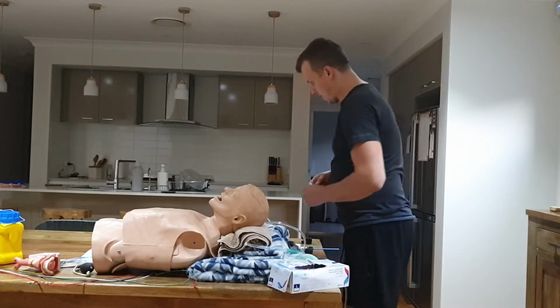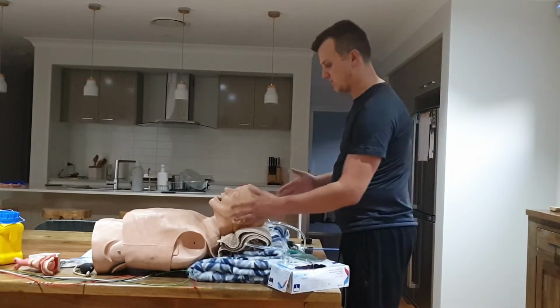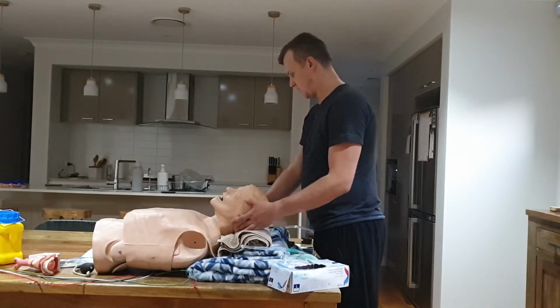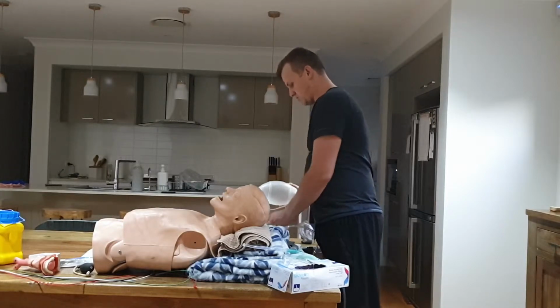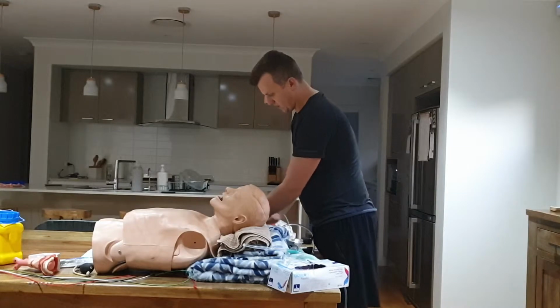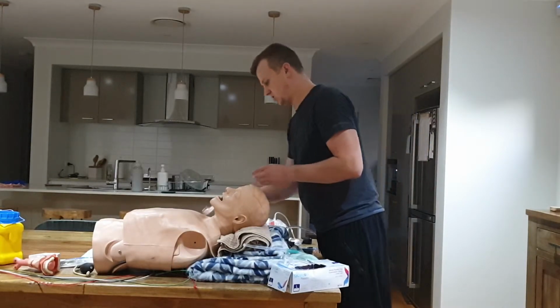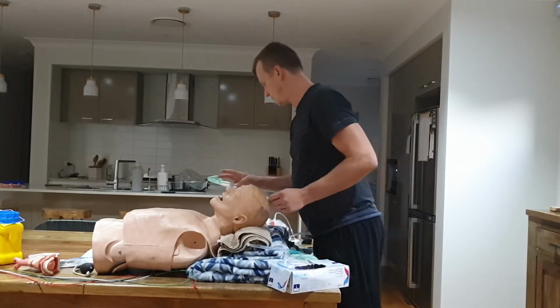Alright. Now for positioning, we've got them positioned in the ramping position already. We're not protecting the cervical spine at this stage, so we're not thinking of any potential injury. So we're going to have to pre-oxygenate the patient. We use a BVM attached to a mask for ventilation. Now you might have to upgrade the airway a little bit as well, so consider the use of your OPAs or your NPAs to oxygenate the patient. Now if the patient has facial hair or has difficulty ventilating, you can consider using an LMA as well.